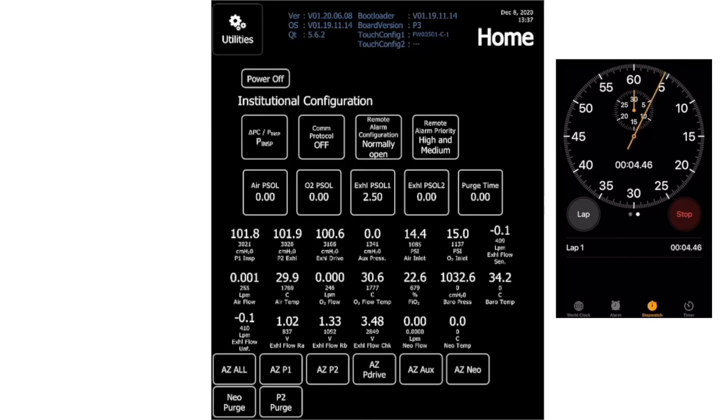So start the timer. You notice the timer on the right-hand side of the screen. And both my P1 and my P2 values have remained over 90 for 10 seconds. So now my inspiratory and expiratory side are tight, so it passed the leak test.